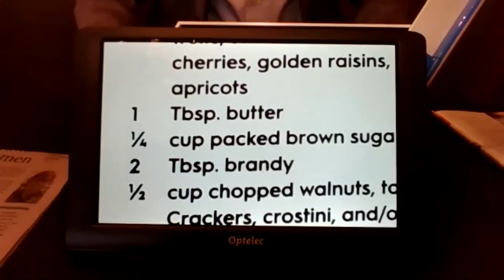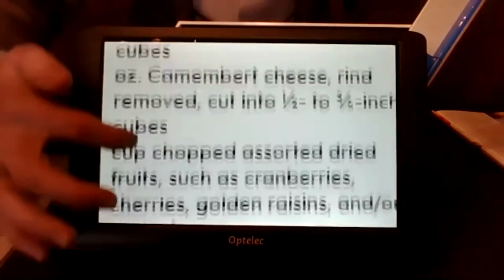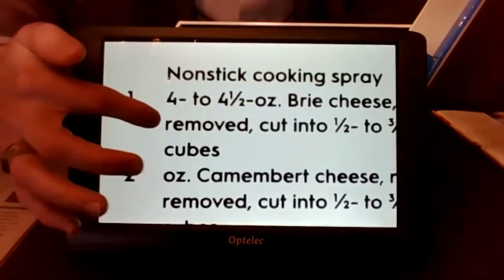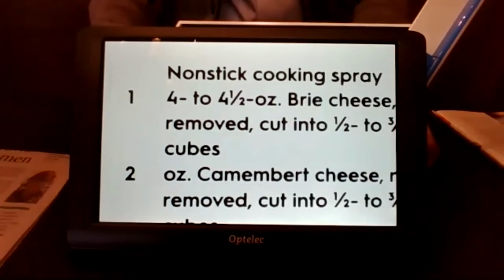So a super perfect example as well of navigating text in a different way. Rather than you moving the magnifier over and above the text, which, in this instance, you've got a magazine, which can sometimes be tricky to navigate, to move a magnifier across a document like that, a book with curvatures in it and whatnot.